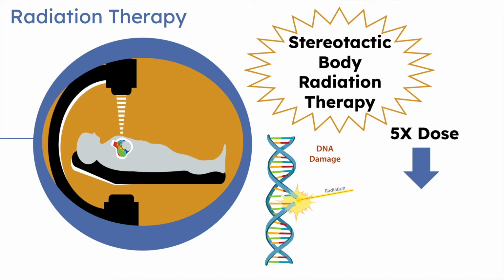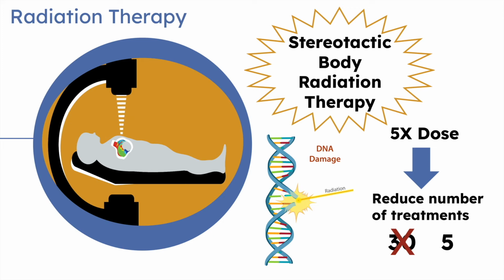By upping the dose, it reduces the overall treatment time from 30 treatments to 5 or less. The increased dose in SBRT treatment is both effective and, due to fewer appointments, it puts less of a burden on the patient and the healthcare system.